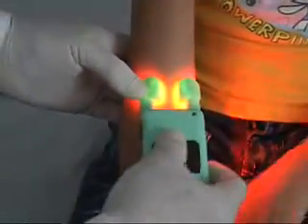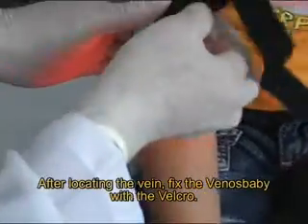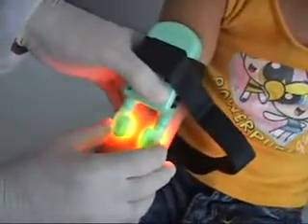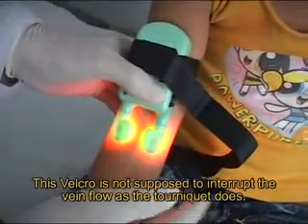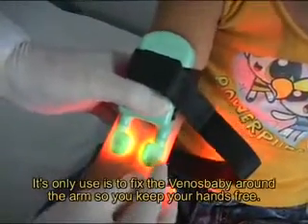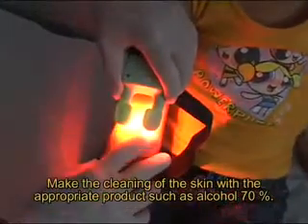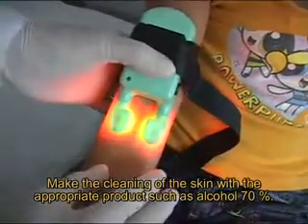After locating the vein, fix the VENOS BABY with the Velcro. This Velcro is not meant to interrupt the vein flow as a tourniquet does — it is only to secure the VENOS BABY around the arm so you keep your hands free. Then clean the skin with appropriate products such as 70% alcohol, and proceed with the puncture as you normally would.